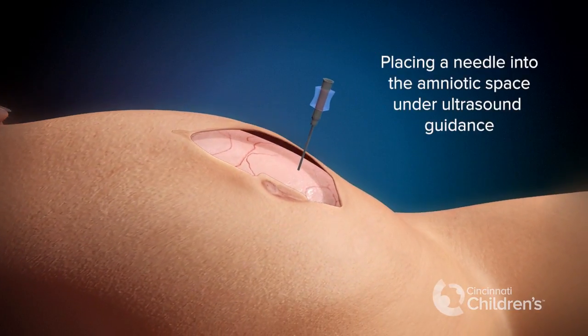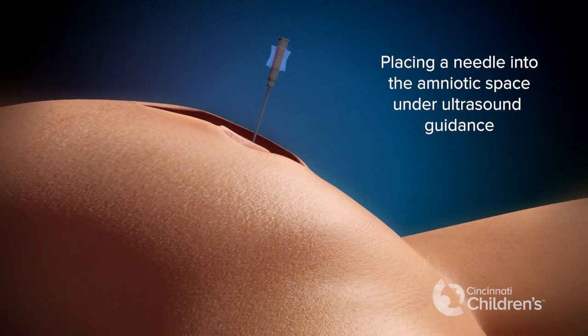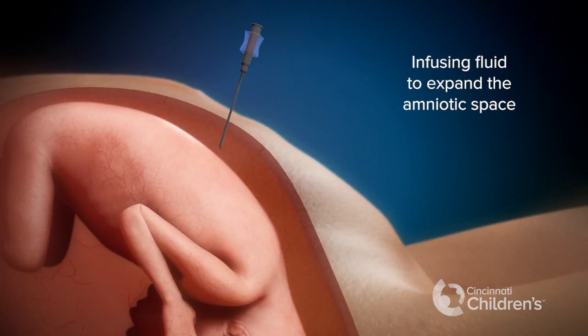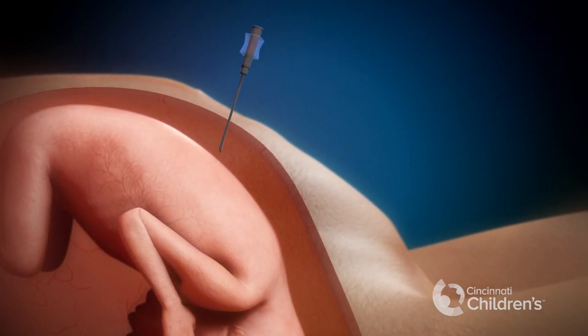The next step is to place a needle into the amniotic space next to the fetus under ultrasound guidance. Through that needle we infuse fluid to expand the amniotic space.